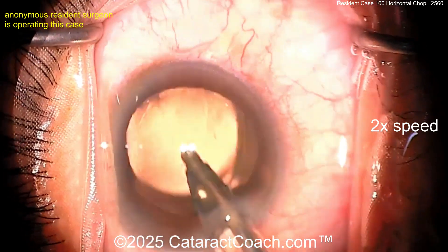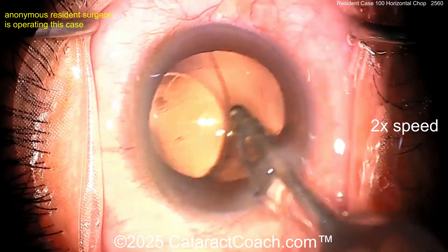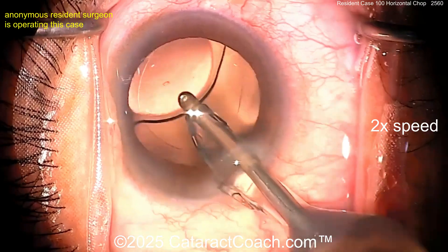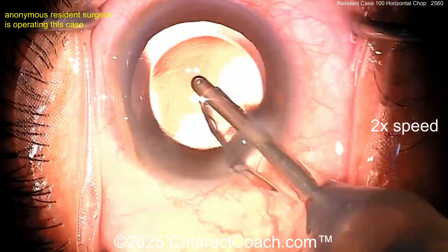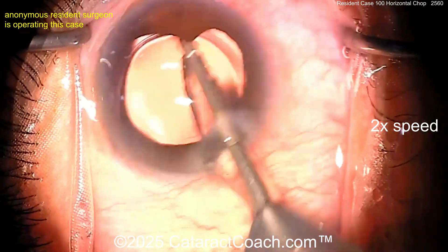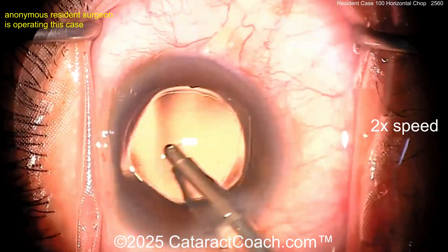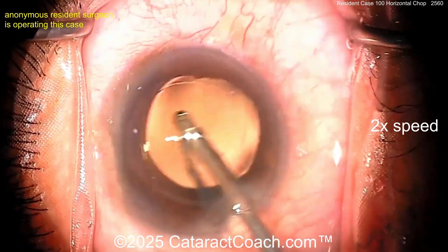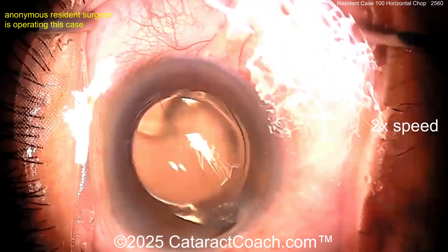I think this case was fantastic. My only suggestions for improvement: first, I'd like the incision to hit a little bit more of the limbal vessels. If it's totally avascular, believe it or not, it never seals well — you could go in ten years later and just use a Sinskey hook. If you barely nick the limbal vessels, it seals so well it won't even open a year later.